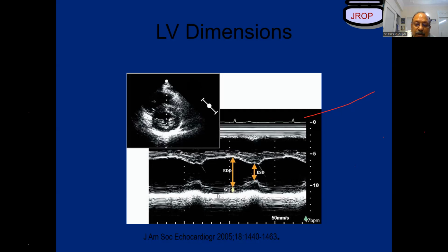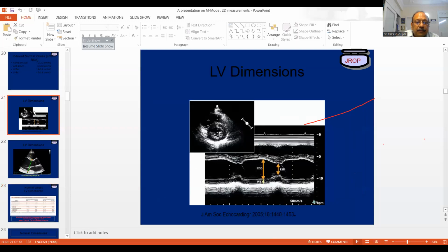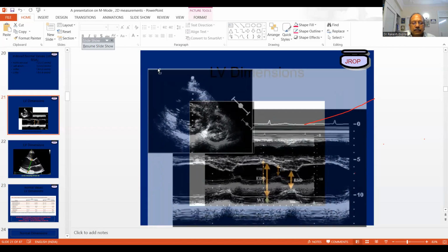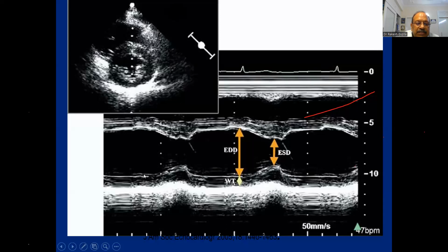That's what somebody asked you: how do you differentiate the myocardium from the pericardium? So here I can show you. Look over here. What is this structure seen over here? Can you see the structure over here? Let me zoom up for you. Now, can you see this structure over here? Wait a minute. Do you see this? What is this?